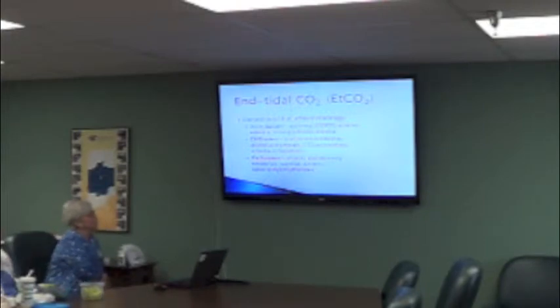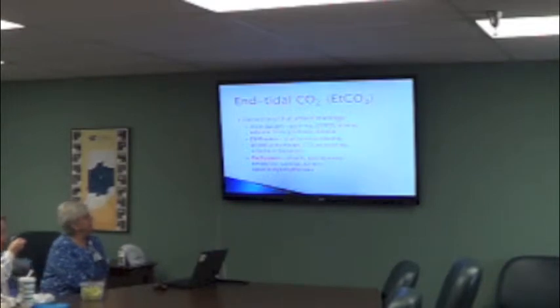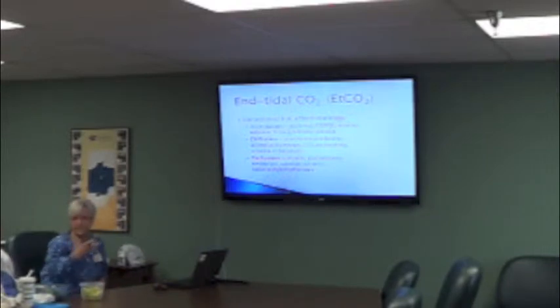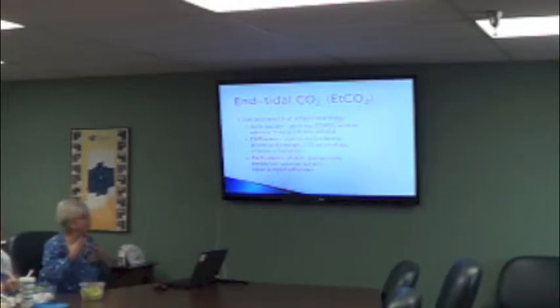And this is a really important slide because nothing we do can we stick on a patient or do to a patient and only look at one thing, look at one number. The end-tidal CO2 depends on ventilation, if you've got the air moving. And in asthma, COPD, edema, a different reason why there's not air going in, that's going to affect it.